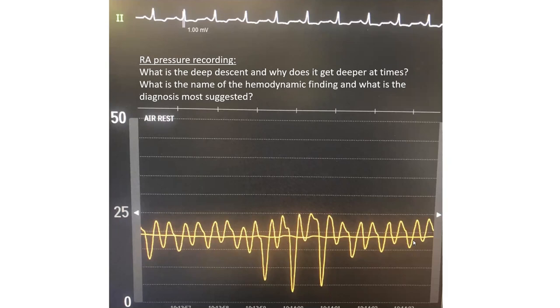This is an RA pressure recording. What is the deep descent and why does it get deeper at times versus others? What is the name of the hemodynamic finding on this RA pressure recording and what is the diagnosis most suggested?